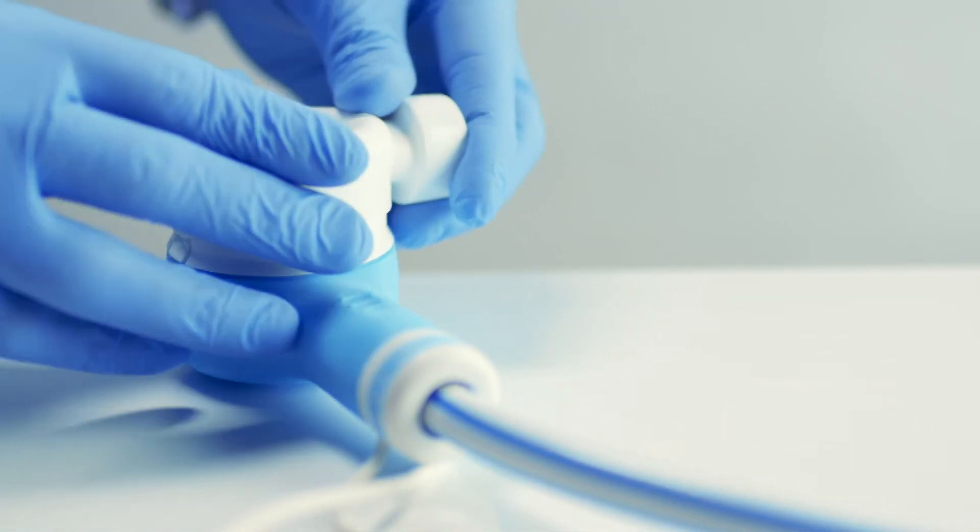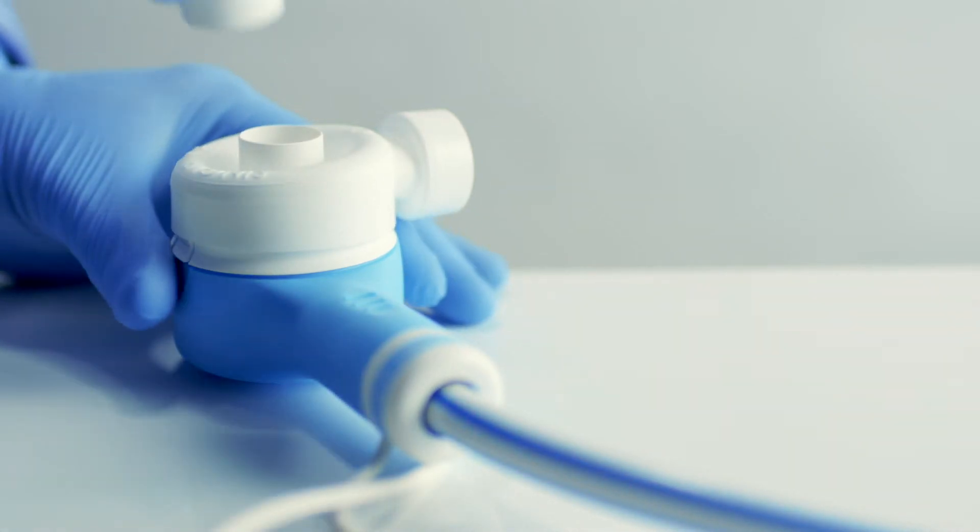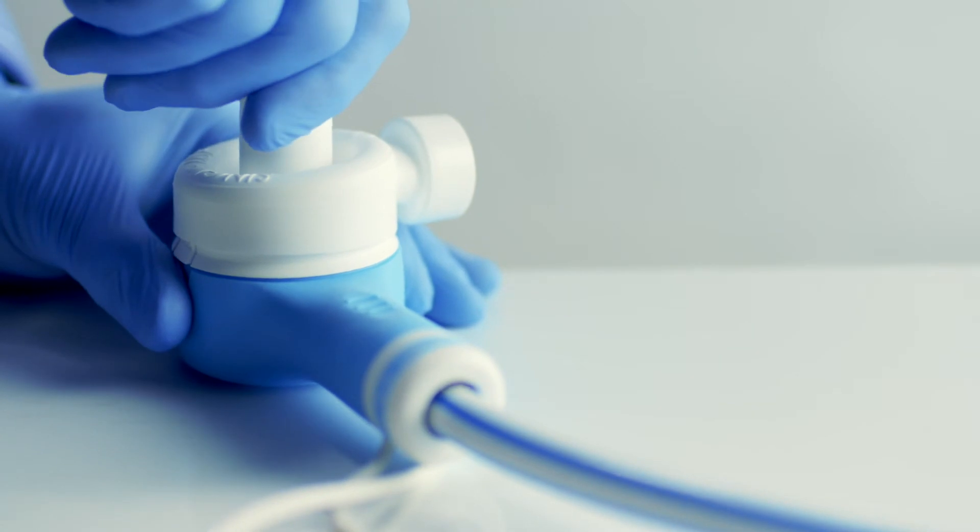If anaesthetic gas scavenging is being connected, fit an AGS diverter over the exhalation valve. Connect a mouthpiece or a face mask as desired.